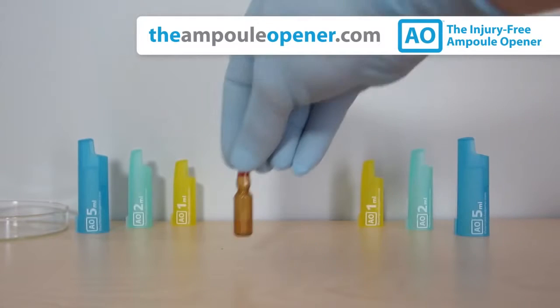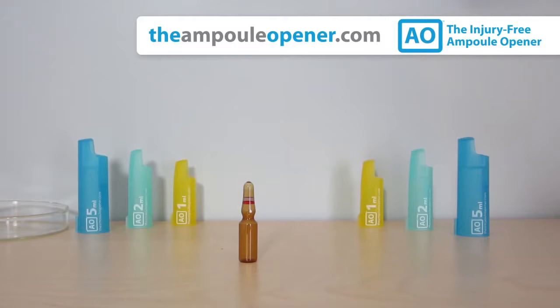To ensure injury-free performance, place the ampule upright on a clean, level, and stable surface.